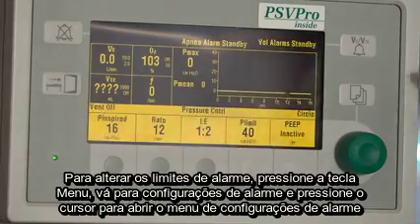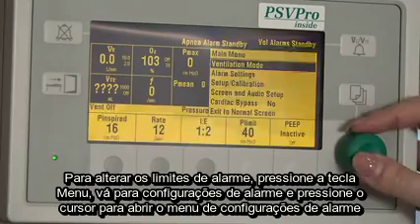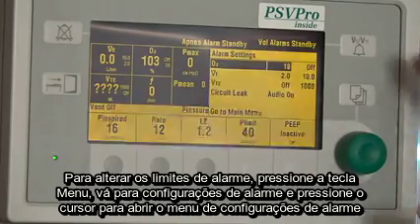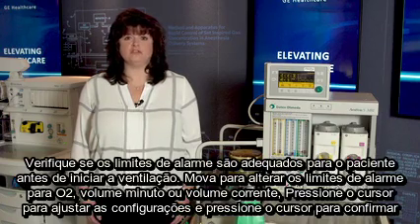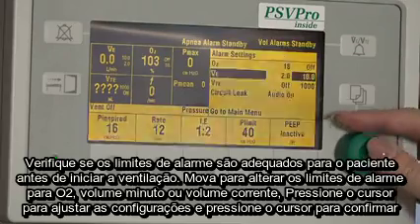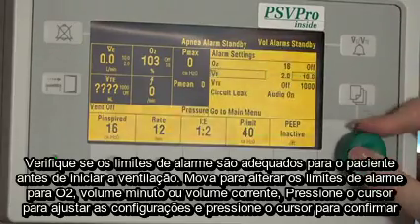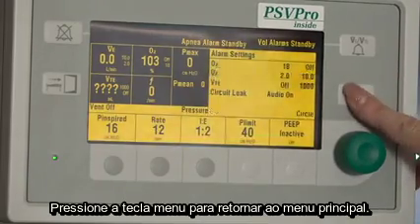To change alarm limits, press the Menu key. Scroll to Alarm Settings and press the comm wheel to open the alarm settings menu. Make sure that the alarm limits are appropriate for the patient before starting ventilation. Scroll to O2 minute volume or tidal volume alarm limits to change. Press the comm wheel, adjust the setting, and press the comm wheel to confirm. Press the Menu key to go back to the main menu.